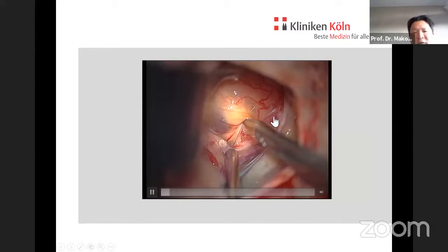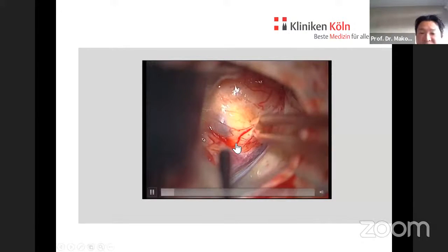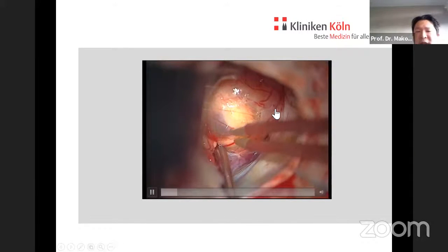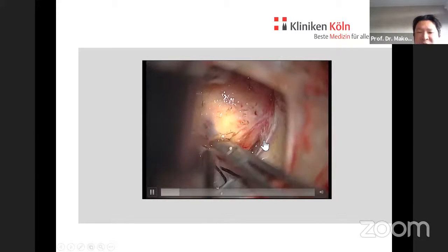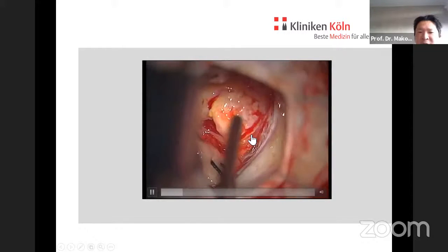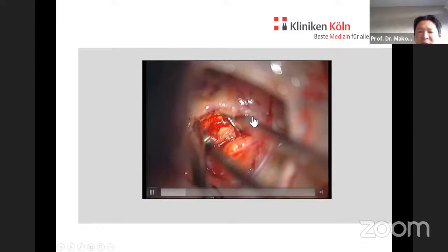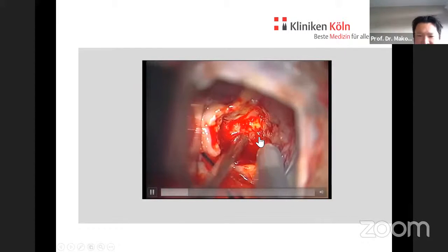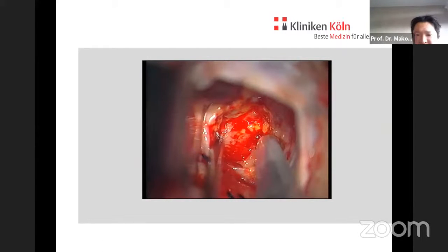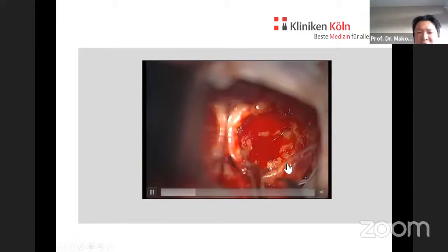So first you need to debulk the tumor. And in vestibular schwannoma, you almost never have a situation where the facial nerve runs here, never. The facial nerve is always displaced ventrally, superiorly or inferiorly, so you never have it here. So you can debulk the tumor here. So first centrally debulk using the ultrasonic aspirator. And the first step is to remove and get space in order to mobilize the edges of the tumor.